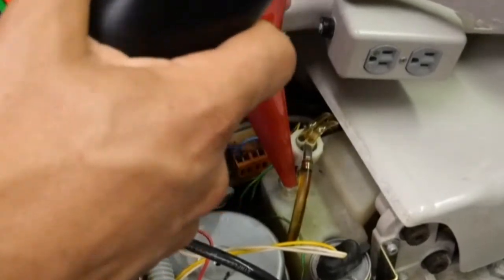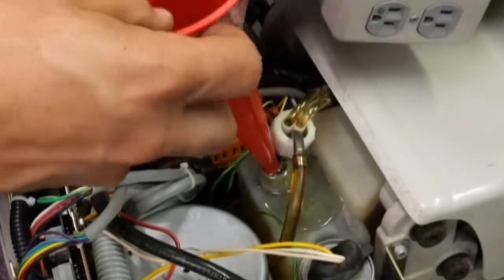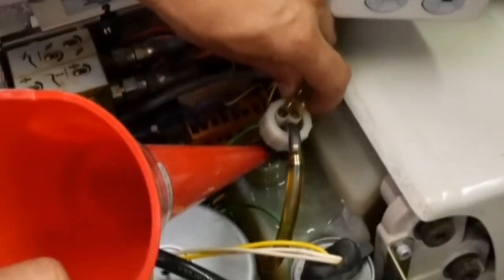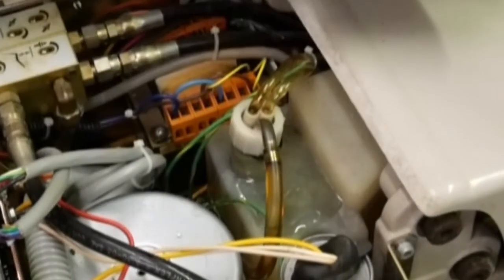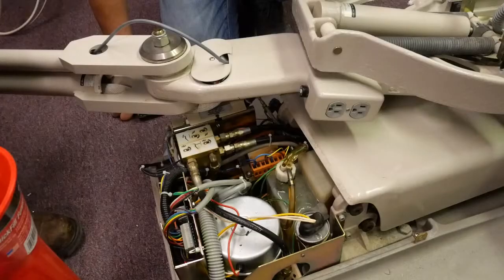All right, and there we go. Whoa, oh no, oh no. Oh, okay. And there, I've demonstrated exactly what not to do. Because that is what should not happen.